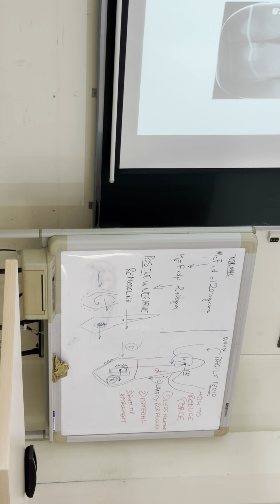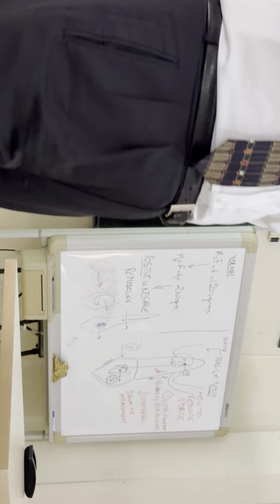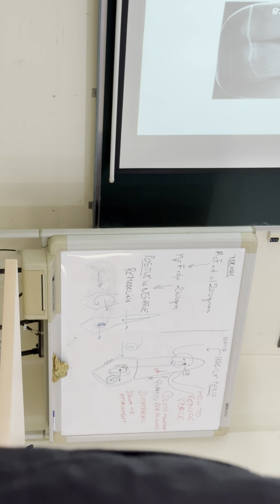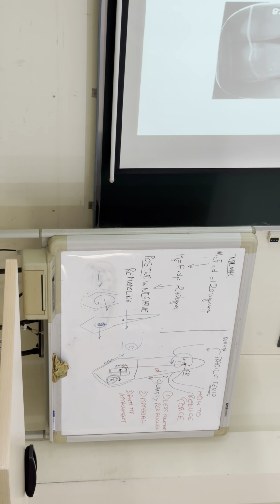Not 10, 35. Why? Because we made the bone. We made bone from here. If you go too quickly, you're going to make the bone here. If you go slowly, it's going to come here, which makes a big difference for the patient. It's positive remodeling versus negative remodeling. If you want to see the case, I'll put it up for tomorrow. But the point was, it took me 35 aligners, not 5 or 10. People say you squeeze everything. No. Take your time. That's an example.